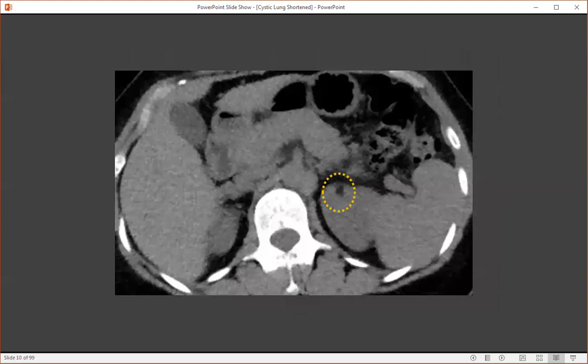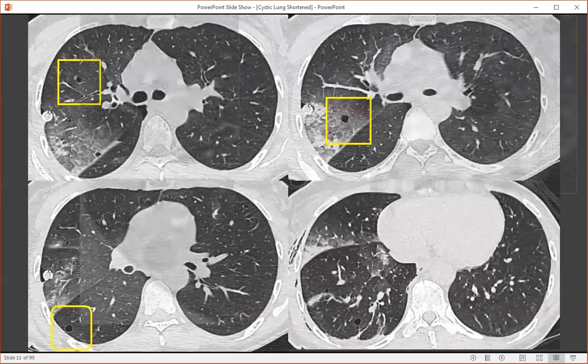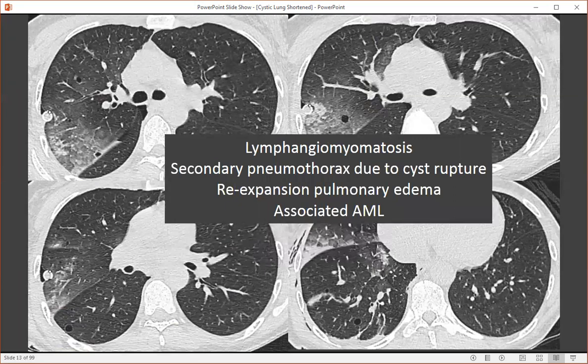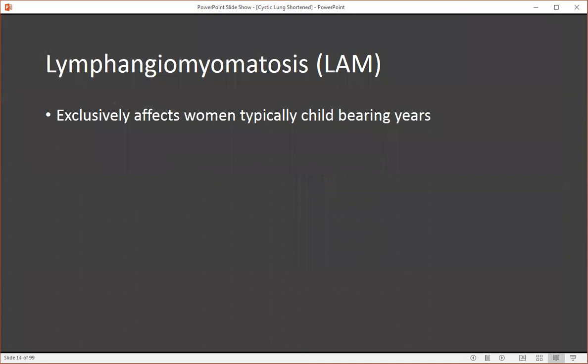In the upper abdomen, there was a macroscopic fat-containing lesion in the upper pole of the left kidney. On our summary slides, we can see that there are several cysts within the lung parenchyma that are thin-walled, regular in shape, diffusely distributed, with new right lung ground glass opacity and a fatty lesion in the left kidney. The lung parenchyma between the cysts is normal, except for this one area. These findings are highly characteristic of lymphangiomyomatosis, with a secondary pneumothorax secondary to cyst rupture, re-expansion pulmonary edema accounting for the ground glass opacity, and an associated angiomyolipoma.